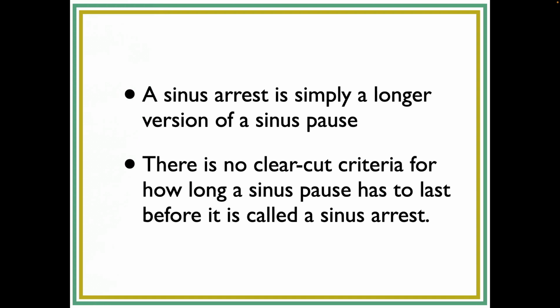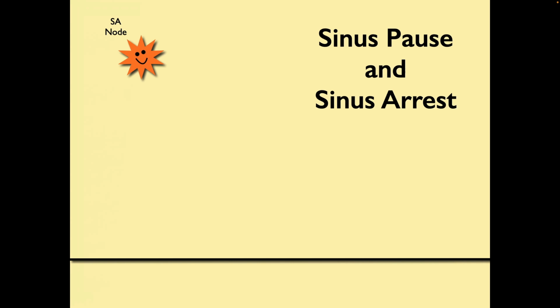And of course, a very reasonable question from you is, how much longer? And to be honest, I don't know, because it's one of those things that's not clearly defined. So I like to think if the pause goes on for 3 seconds or more, let's call it a sinus arrest.